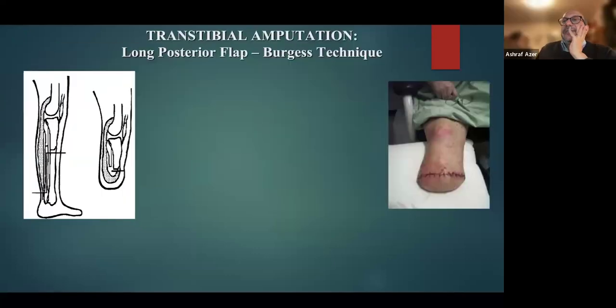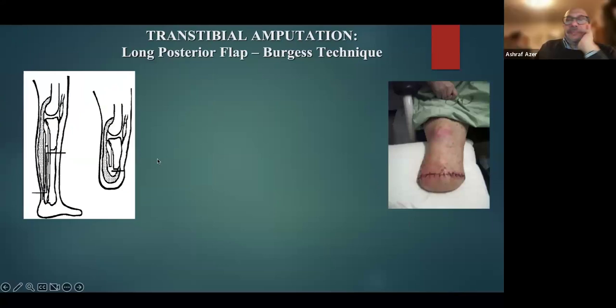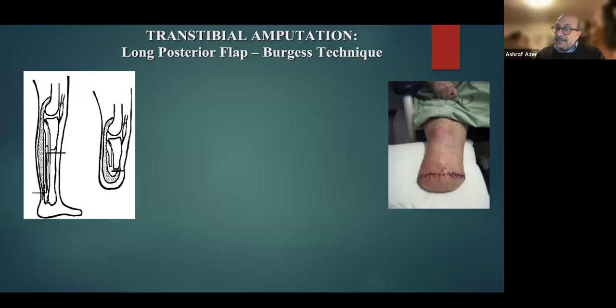Why not more than that? The longer, the better. Okay, I'll make it easier for you. You measure it like this: for every meter of height, you take 8 centimeters. If the patient is 170, the length you should do is about 15 centimeters. Okay?